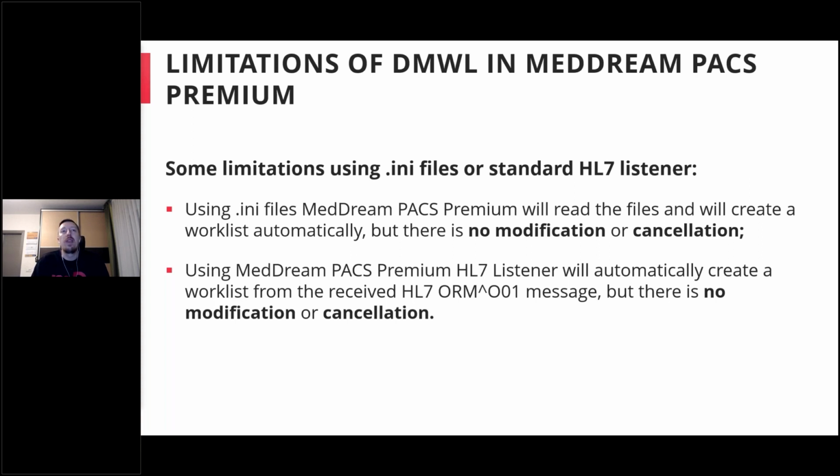And also using the HL7 listener, it has some limitations regarding the tags which can be passed, because it takes only the really required tags and will not store, for example, referring physician, requesting physician, or other information. And also there is no cancellation or modification when you are sending to the standard HL7 listener of the PACS Premium.